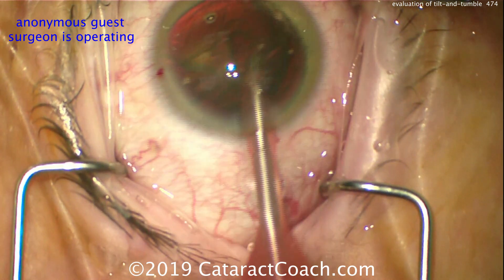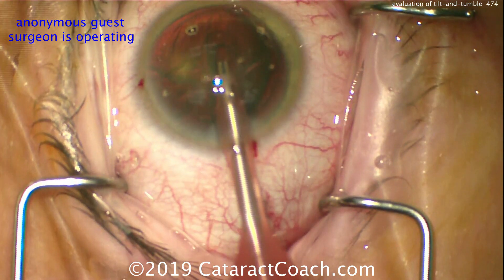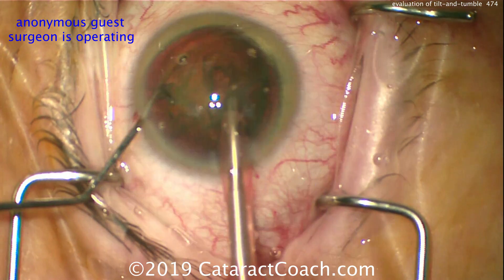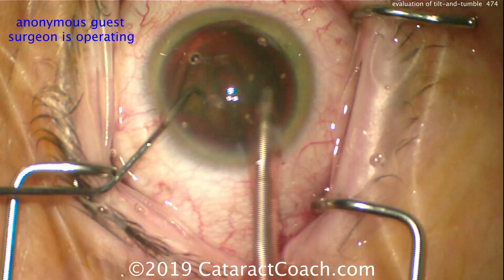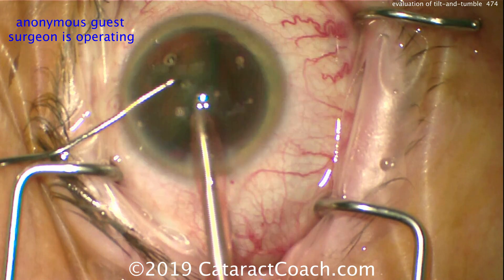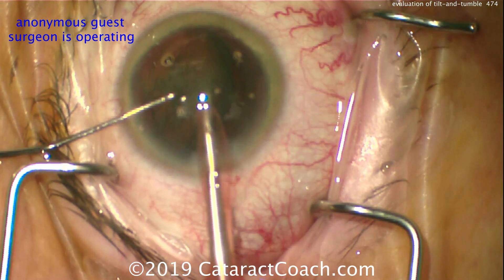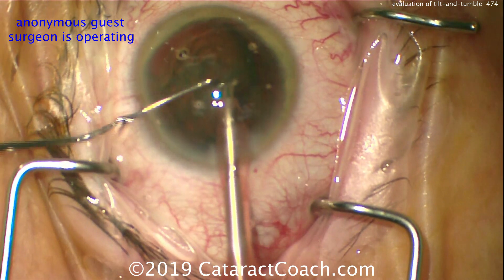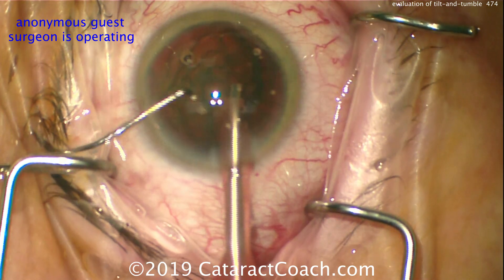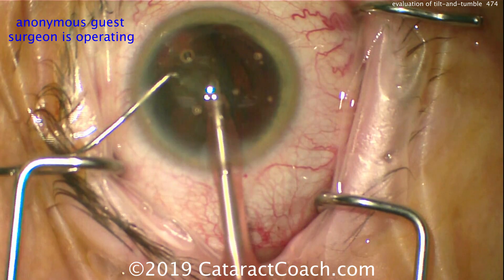So here, just digging into it, making a little bit of a groove. Now that nucleus is tilted up like this, you can split the nucleus a little bit more, or you can just keep wolfing it down. The preference here for me is just to bring it up, tilt it even more, and just keep aspirating — tilting it out of the bag and then tumbling. Tumbling means just bringing all the pieces of the nucleus towards the FACO probe. The chopper hand is going to do a lot of delivering of the nucleus and keeping it in front of the FACO probe.